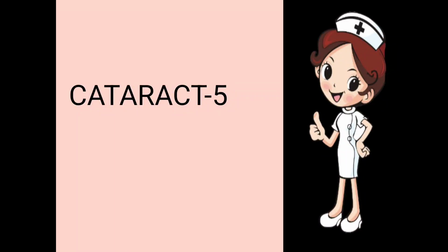Everyone, today I am giving you information on the topic cataract part 5, in which we'll discuss how to calculate the axial length. As we have seen in part 4, we have the IOL Master, which is used to calculate the intraocular lens power very accurately.